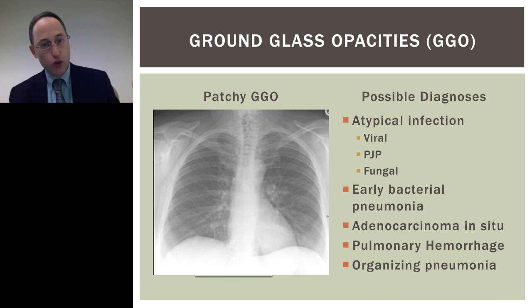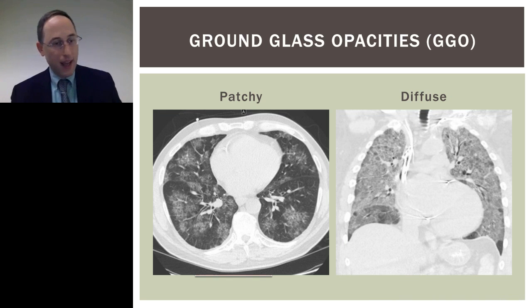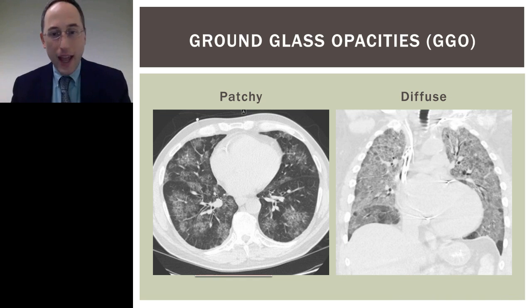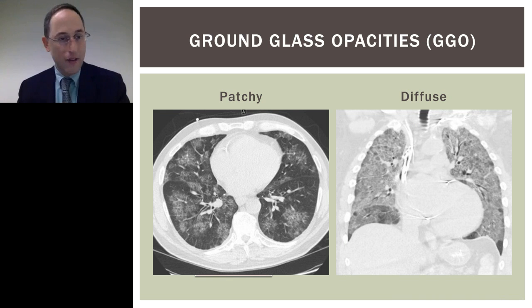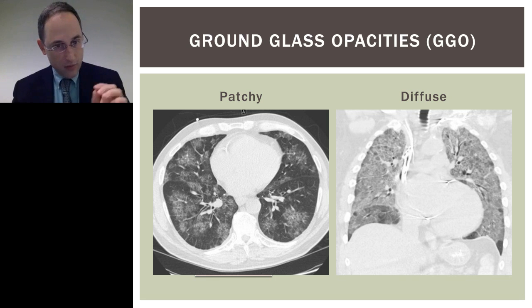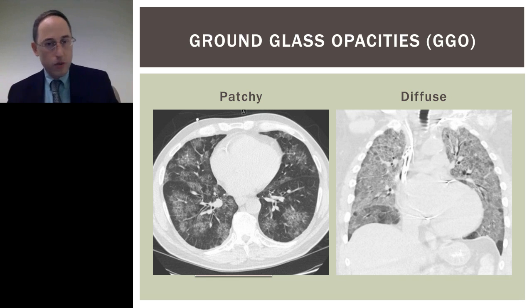It looks normal. Okay? Now, ground glass is present in this patient, and I've listed the possible diagnoses based on the finding of ground glass. Now, depending on the pattern of ground glass, I would narrow this differential, but essentially looking for ground glass is a challenge. And the question is, can tomosynthesis see ground glass better than radiography? That would be very, very important.